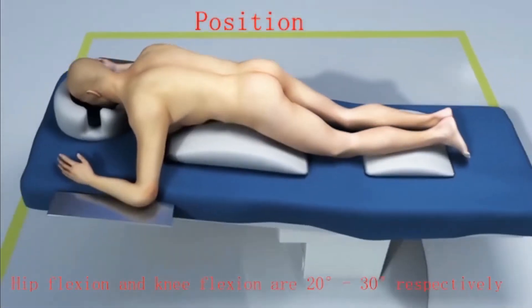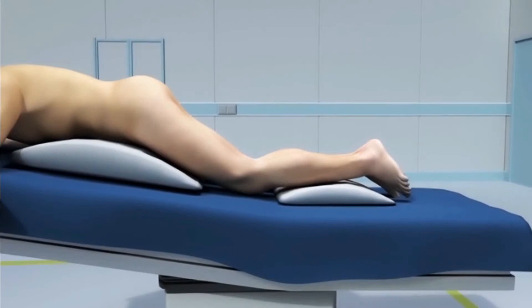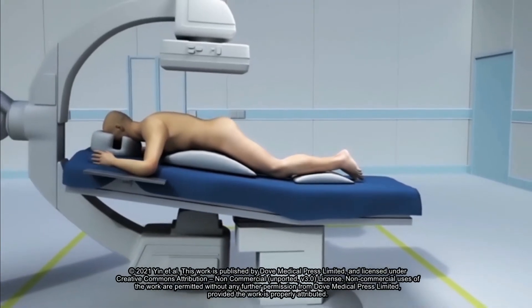The patients were positioned prone on a radiolucent table. The angle of hip flexion and knee flexion was 20 to 30 degrees respectively.